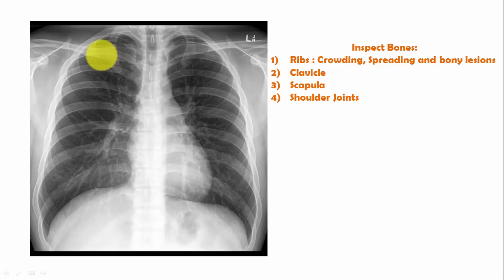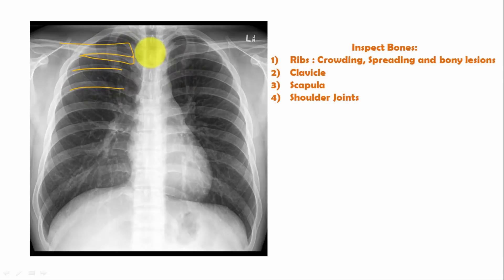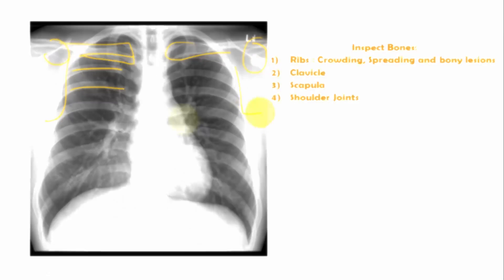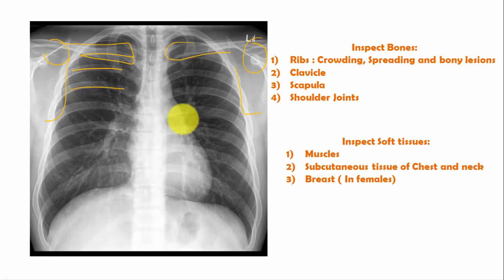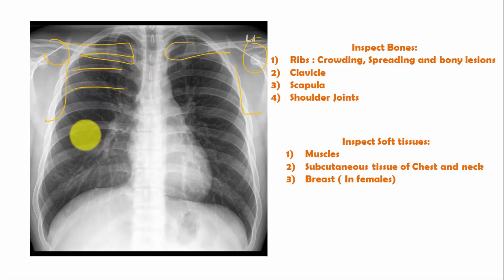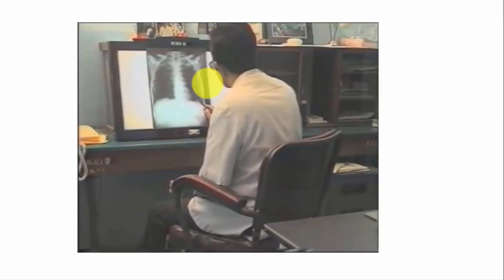After inspecting the lung fields and cardiac shadow, inspect the bones. Look at the ribs for crowding, spreading, and any bony lesions. Mark and examine the clavicles, shoulder joints, and scapula. Also note the soft tissues — look at the muscles, subcutaneous tissue of the chest and neck, and in females also examine the breasts.